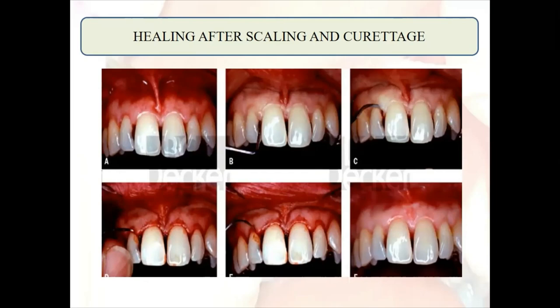So basically, we did a gingival curettage procedure, especially in the area distal to the 1-1. The immediate post-operative change was enhanced inflammation in that area. Different kinds of inflammatory mediators were present in that area. The re-epithelialization and the collagen fiber organization all started taking place.